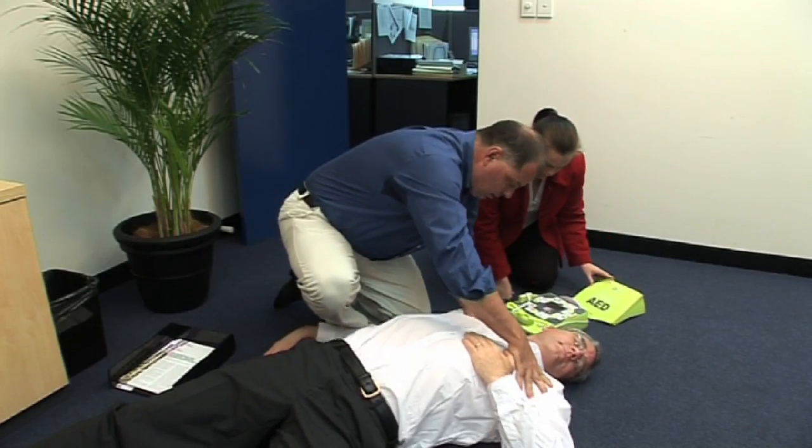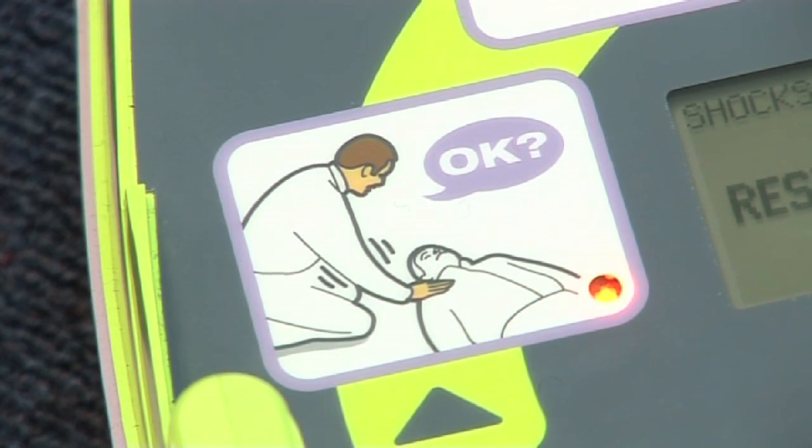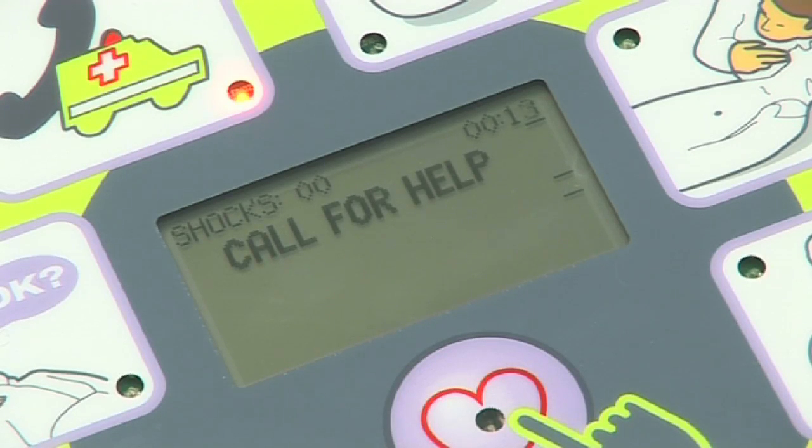The first command you will hear is to check for patient responsiveness. Do this by asking the patient to squeeze your hand or asking, are you okay? If you suspect that the person has had a cardiac arrest, then immediately have someone call an ambulance.